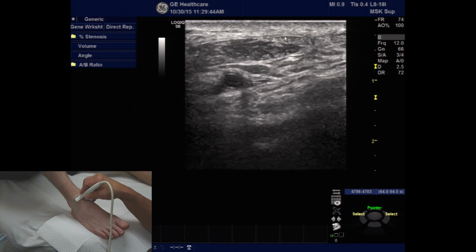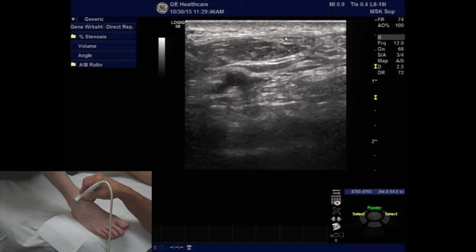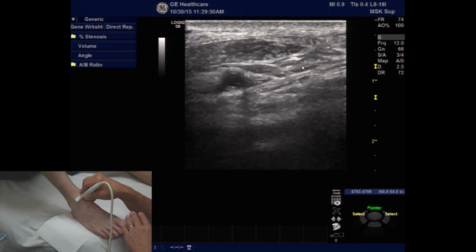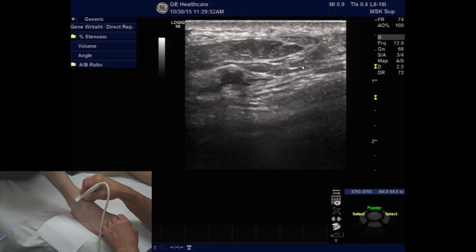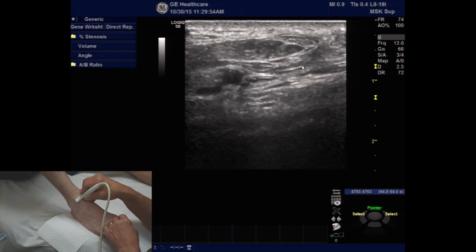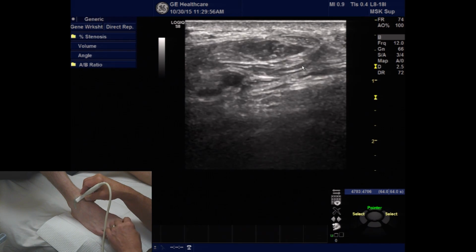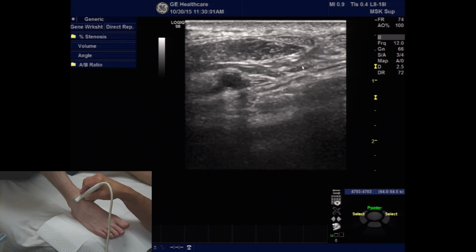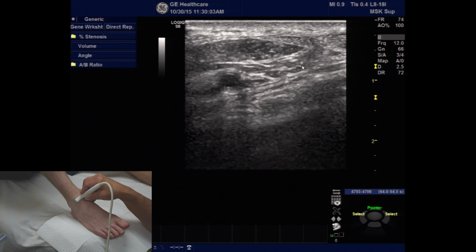You'll see some very thin fibers that roll across the top of the tibialis anterior and the extensor hallucis, which is the extensor retinaculum. A very good way to test which tendon we're looking at is if you move the large toe, you can actually see the muscle of the extensor hallucis flexing back and forth, which guarantees which tendon and muscle structure we're looking at.